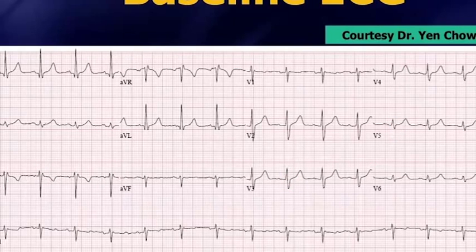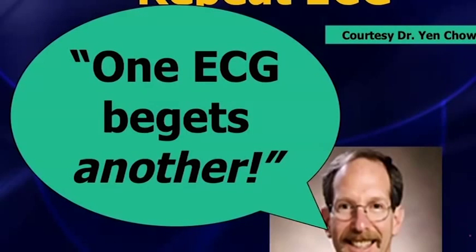Well, Dr. Chow was not going to be fooled by this, and he decided to go ahead and get a repeat EKG, and largely that's because of teaching by a very famous emergency physician in Nashville that I've quoted before at Vanderbilt, the chairman of the emergency department, Dr. Corey Slovis, who one of the most important things that I've learned from him is his concept that one EKG begets another. In other words, when in doubt, in fact, not even when in doubt, he'll just say, when you get one EKG, it should lead you to get another one.